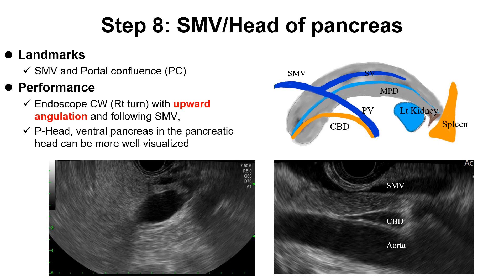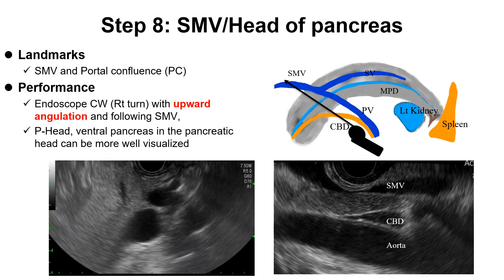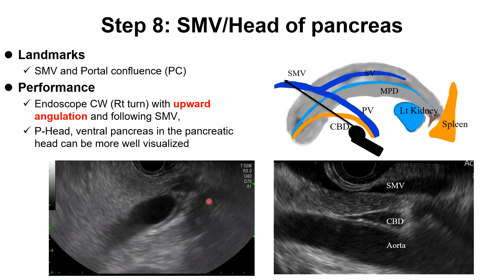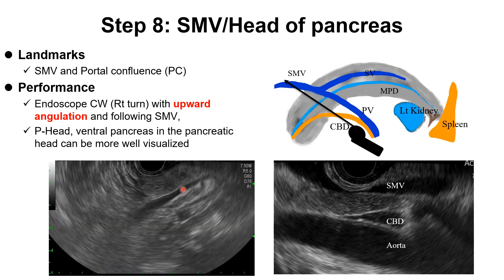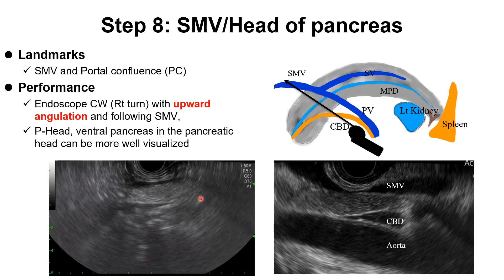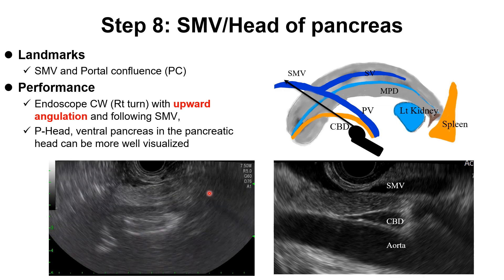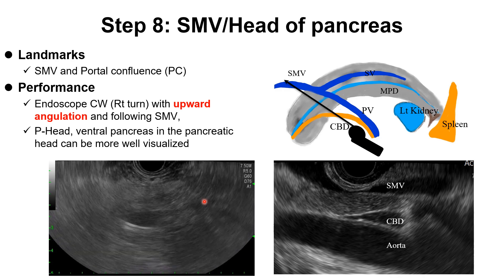Step 8: SMV and pancreas head. In this area, the landmarks are portal confluence and SMV. With clockwise rotation and upward angulation, following the SMV, we can see the lower portion of the pancreas. We can also see the ventral pancreas in this imaging. Video clips show dilated CBD and SMV. Following the SMV, we can see the lower portion of the pancreatic head including the ventral pancreas — a low echogenicity area.